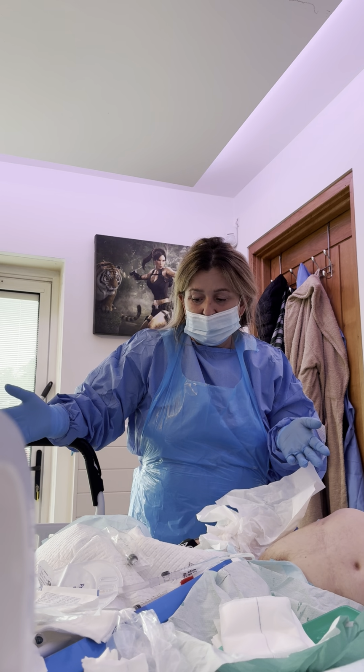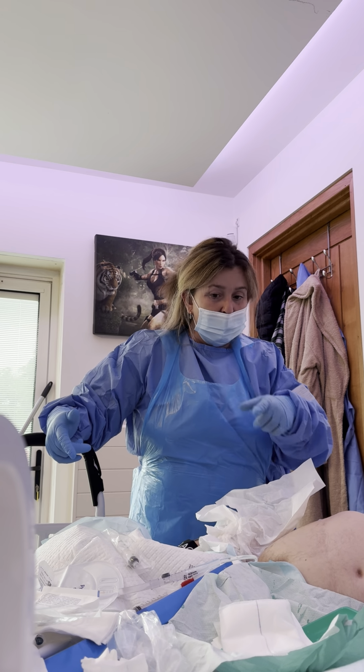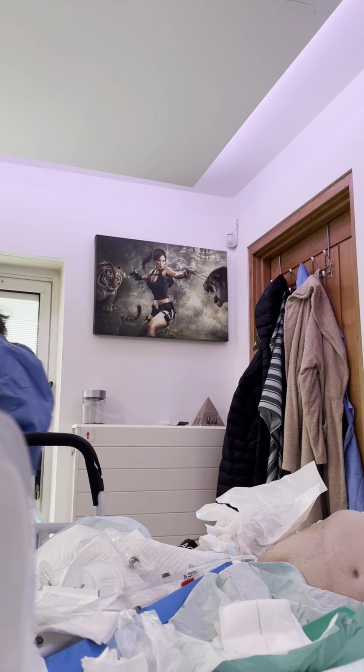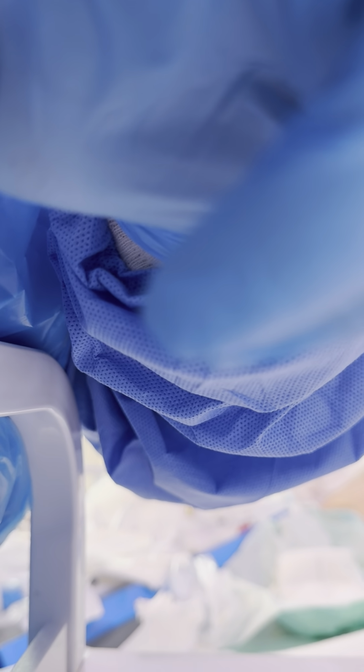Just a little bit of blood that's come out, which would have stayed around that balloon, a circle round it. When I blow it up, I'll do it right in front of you. Let me get some saline, because I wasn't expecting that, to be fair. And always do another reading.